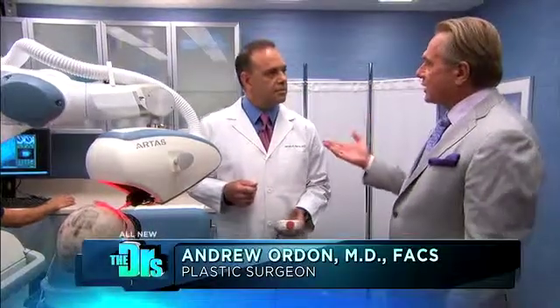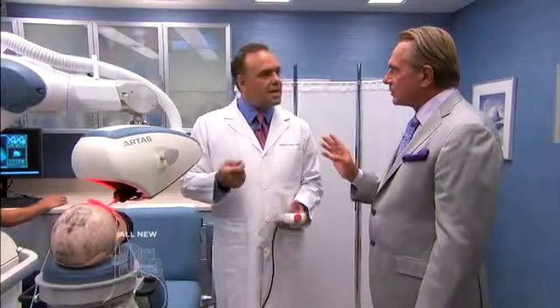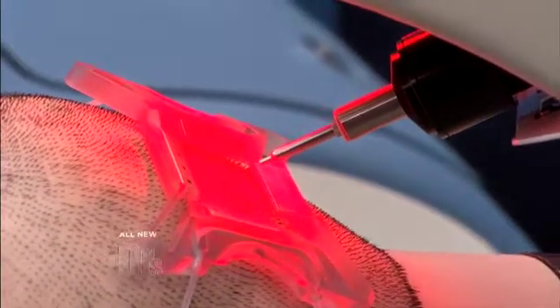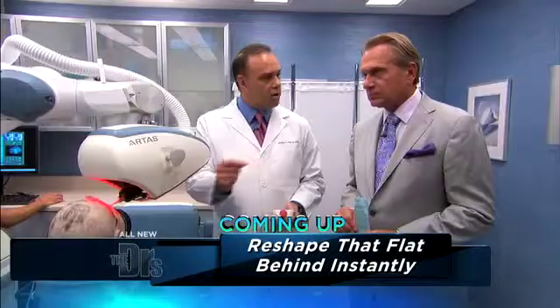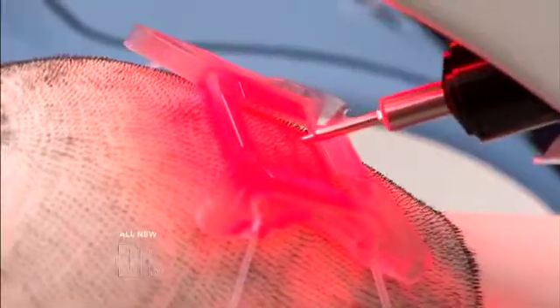I would think this is going to be much quicker than the old fashioned techniques, isn't it? When it's going through this process, it's actually doing about a thousand grafts an hour, which is very, very fast. Wow, that's moving. It is moving very quickly. It's an amazing technology. The main advantage for the patients is that it's minimally invasive. It doesn't leave that long line scar at the back so they can wear their hair short if they want to. There's more rapid healing and they can get back to activities much more quickly.